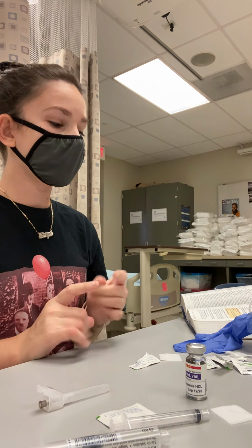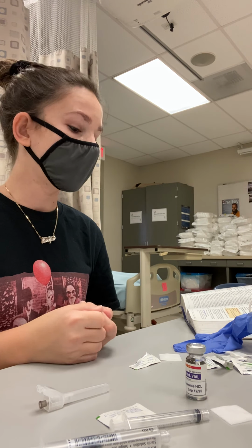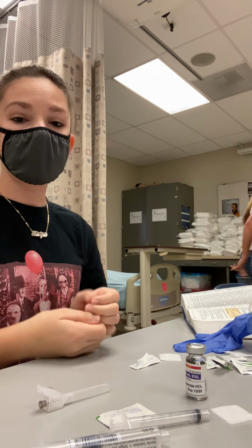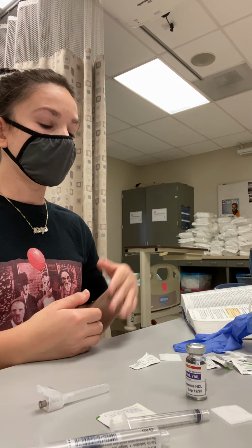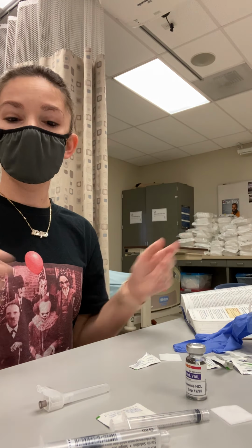So you will document what medication you've given, the time, the dose, the route, and you're going to sign your name and how the patient tolerated it. And then you will come back in 15 minutes, assess the patient, and do another set of vital signs. And you will make sure the patient is comfortable before you leave and that the call light is within reach. And that is it.